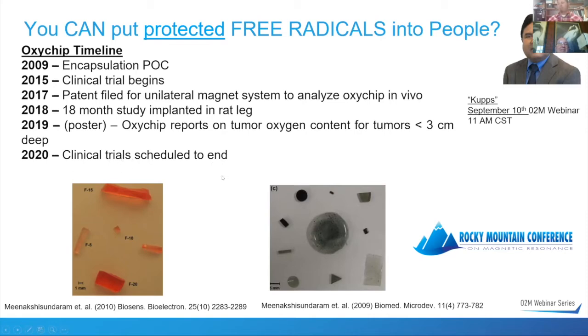You know, MRI has seven different commercial gadolinium contrast agents alone that are available to do imaging with, and a number of different imaging sequences. I hope for, and I wish for, a clinical EPR imaging that would cross that bridge, but then we also develop a number of different probe sets that could gain FDA clearance to help bring the really powerful information that EPR imaging can provide to people.